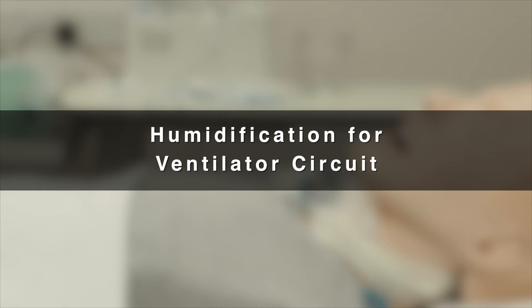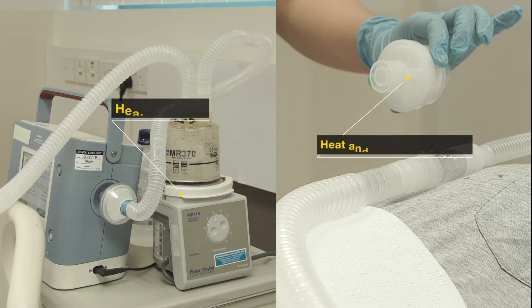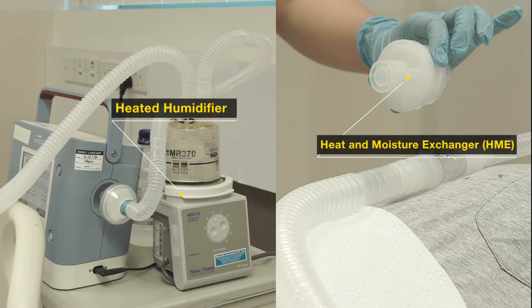With tracheostomy, the upper airway is bypassed during ventilation. Hence, the humidifier is important in preventing heat and moisture loss. It is also recommended to improve patient comfort.